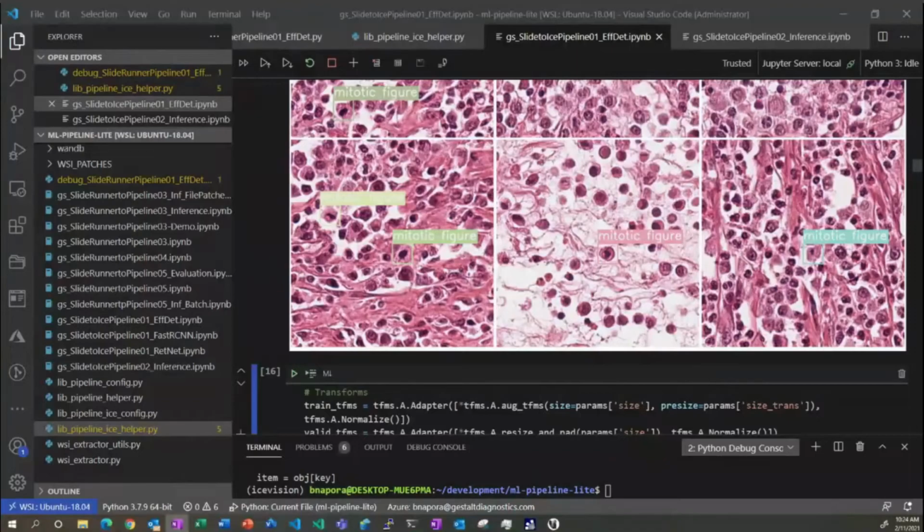So one of the examples for Christian's data set: the canine mammary cancer samples were scanned on a similar scanner to one of the human breast tissue samples, and got much closer accuracy.